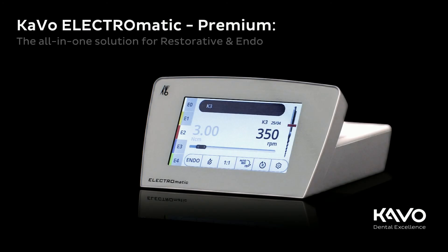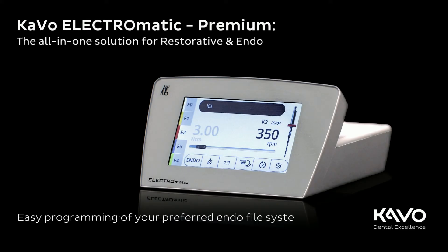KaVo ELECTROmatic Premium, the all-in-one solution for restorative and endo. In this video you will learn how easy it is to program your preferred endo file systems.